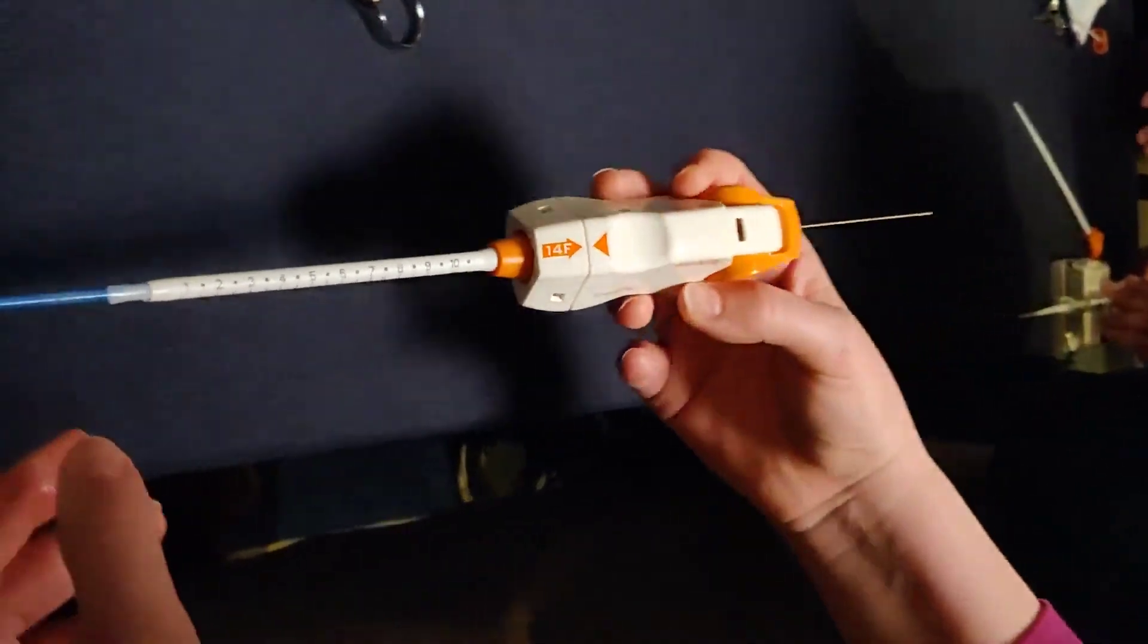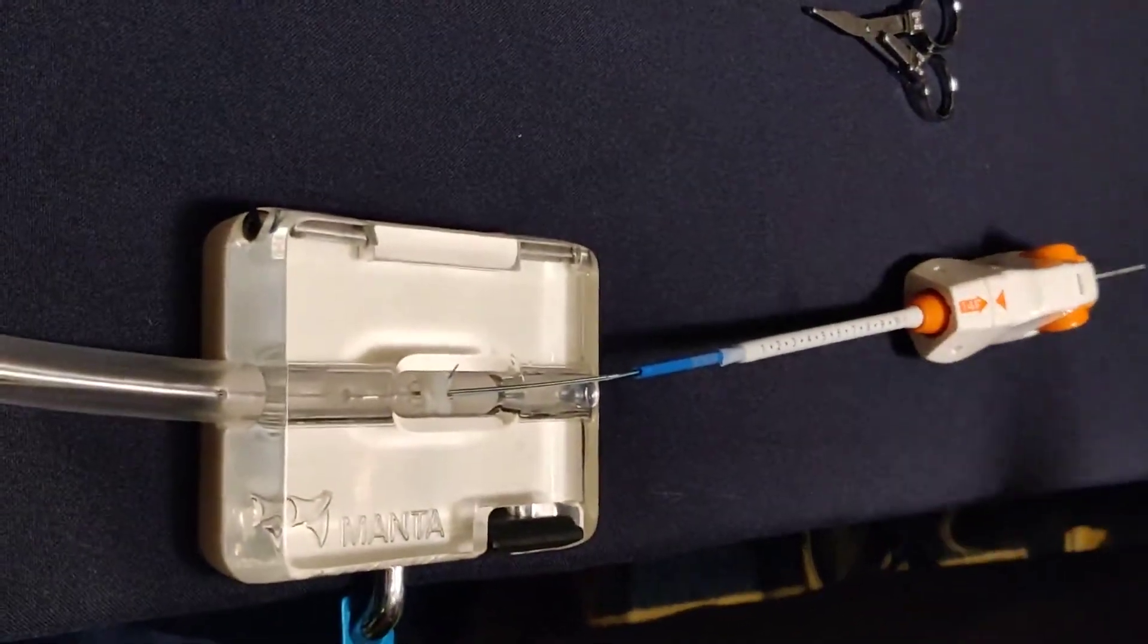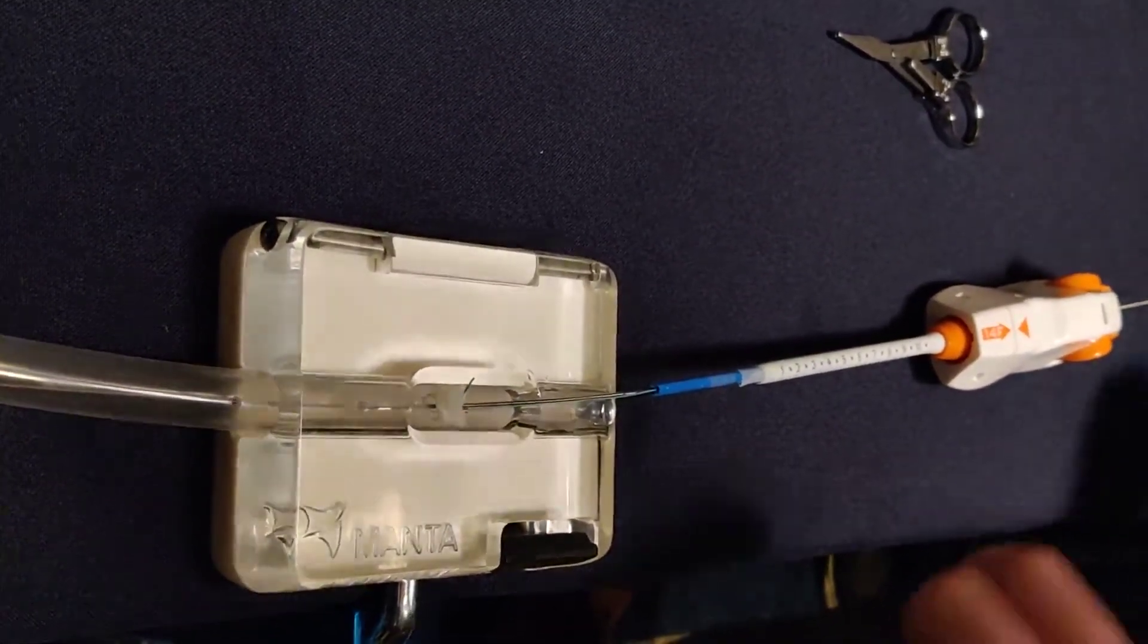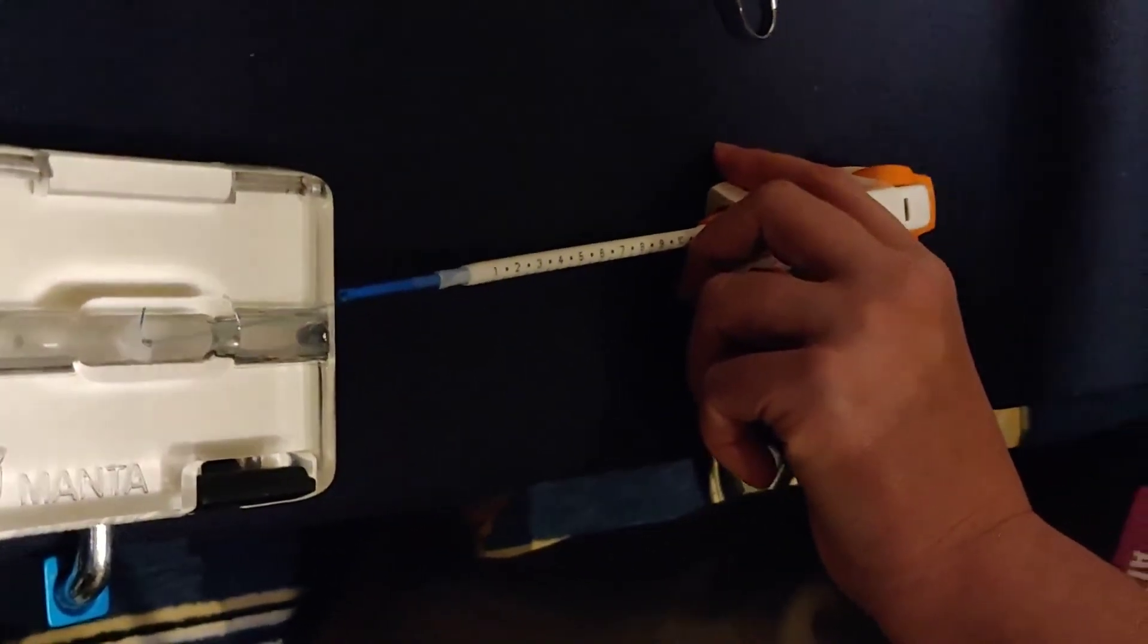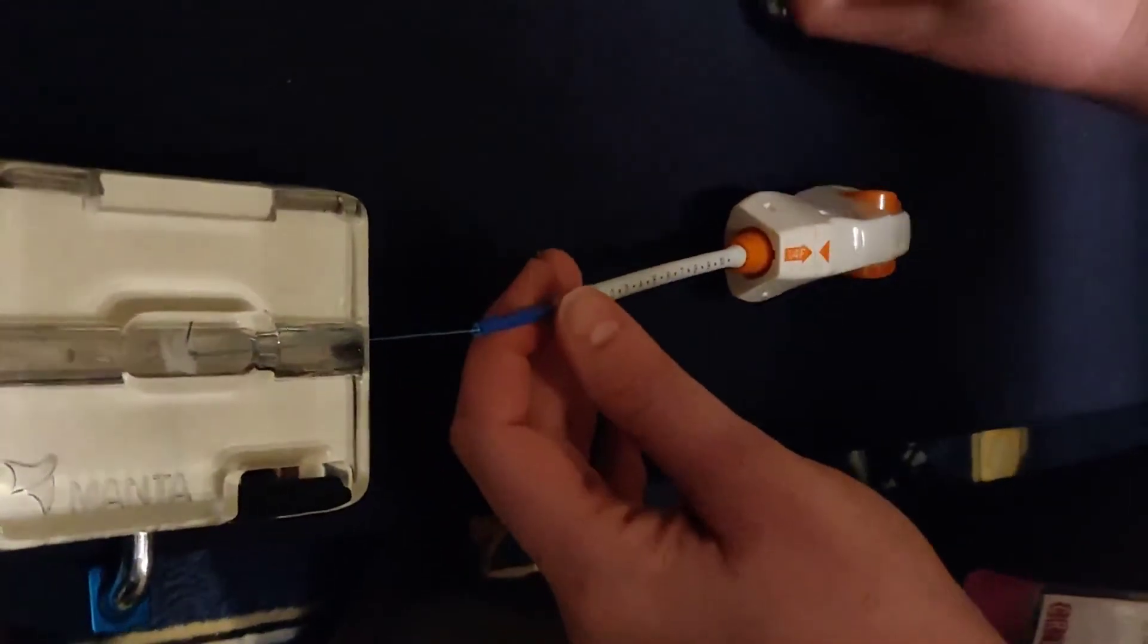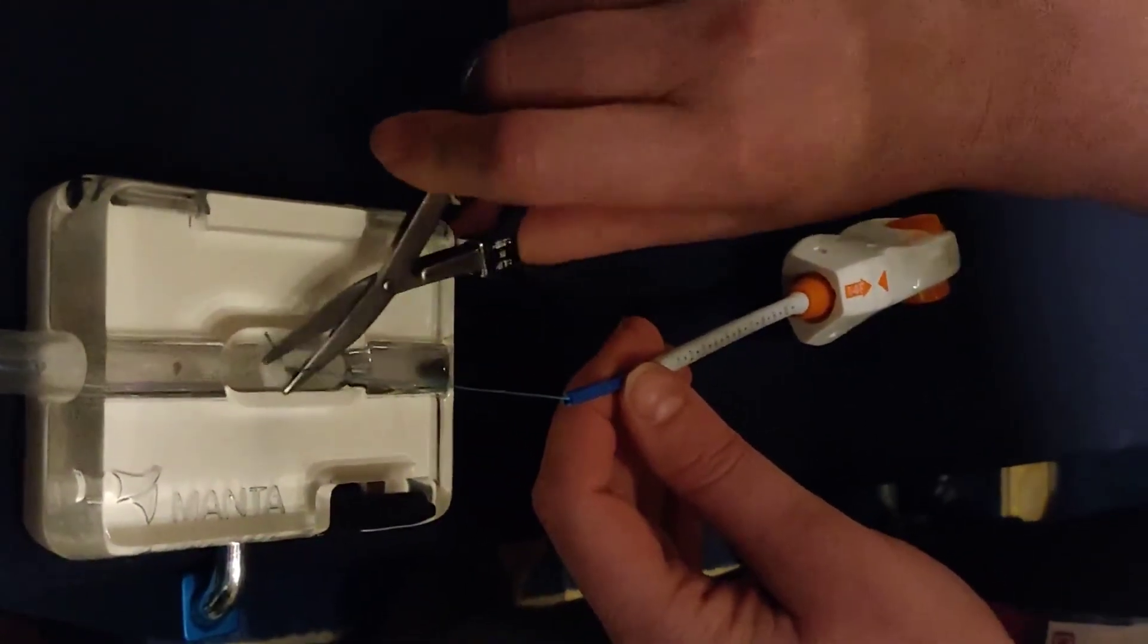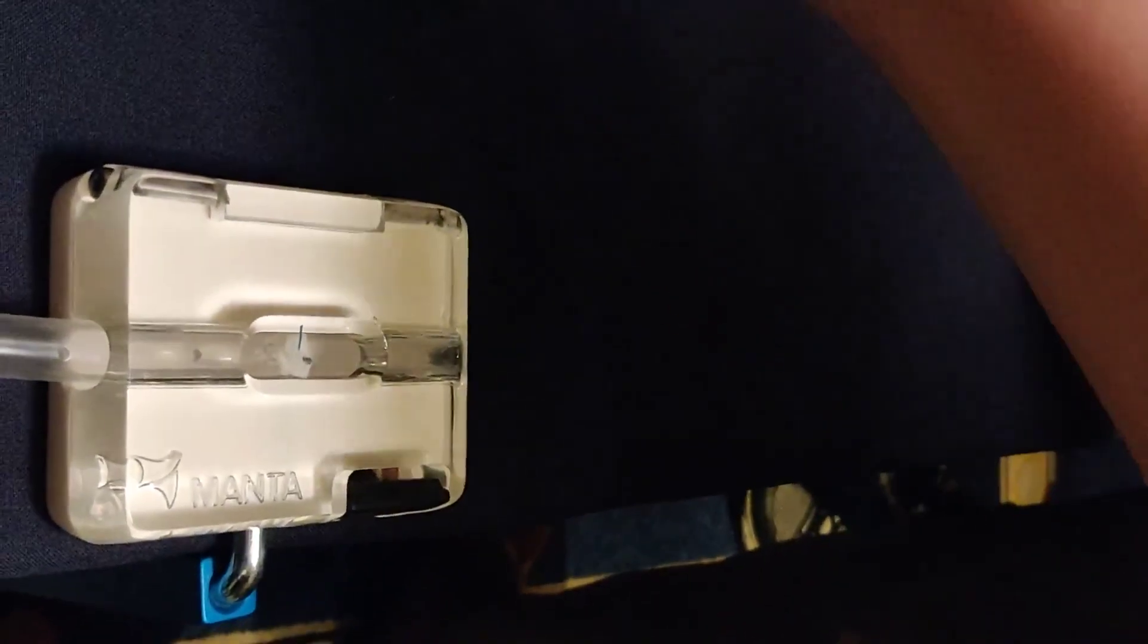So at that point, if you're happy with it, we're gonna have you pull that tooth back out of the track, lay it down. If you're happy with everything, great, we'll have you remove the wire and then cut. There you go. Okay, fantastic, nicely done.